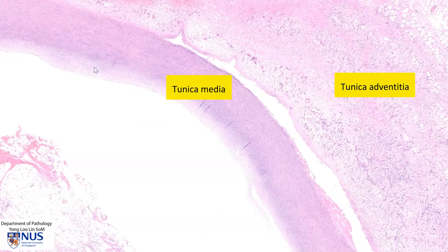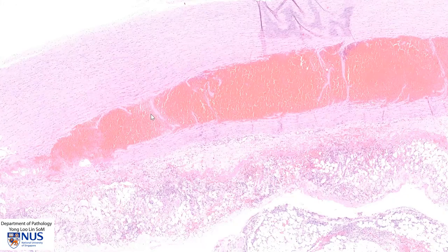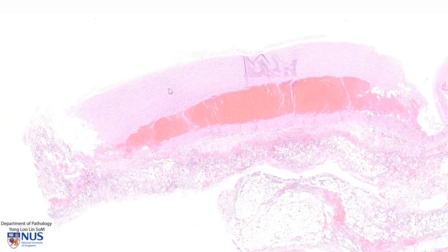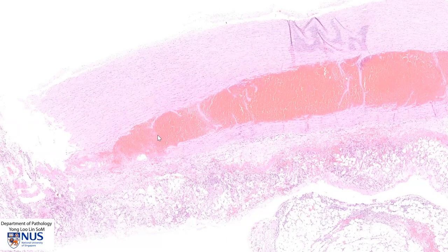Here is another example, but in this instance, the aorta is orientated in the opposite direction. So we can see tunica intima, tunica media, and adventitia. And here is the dissection — we can see this hematoma tracking within the tunica media and splitting apart the tunica media.